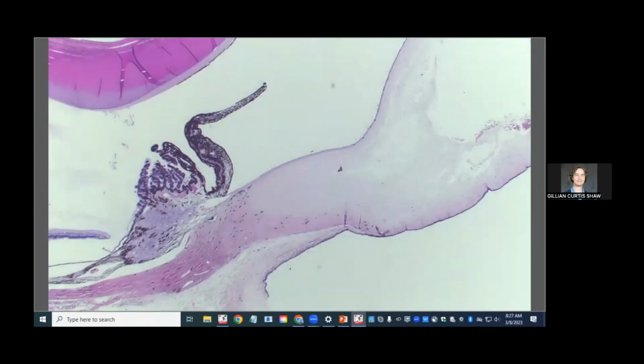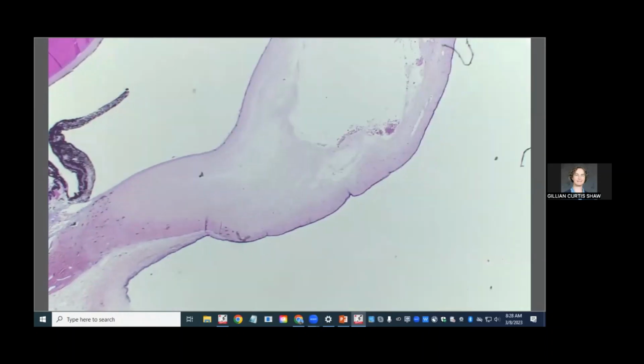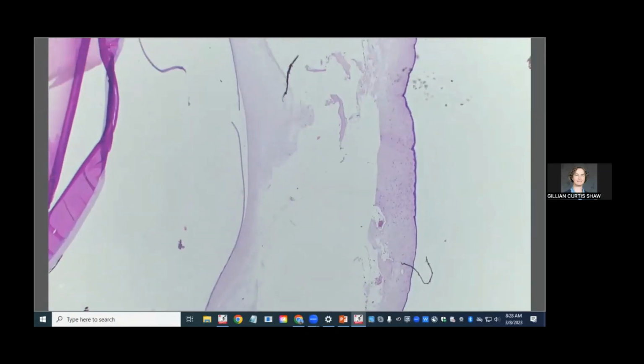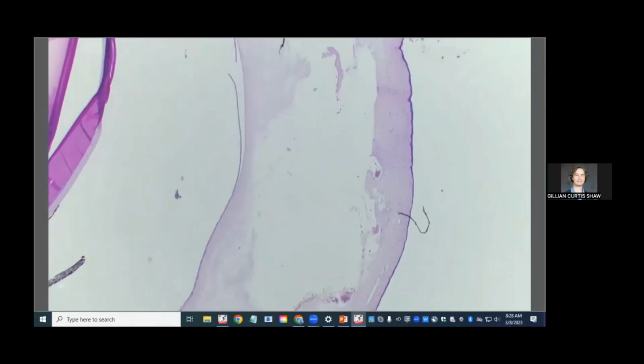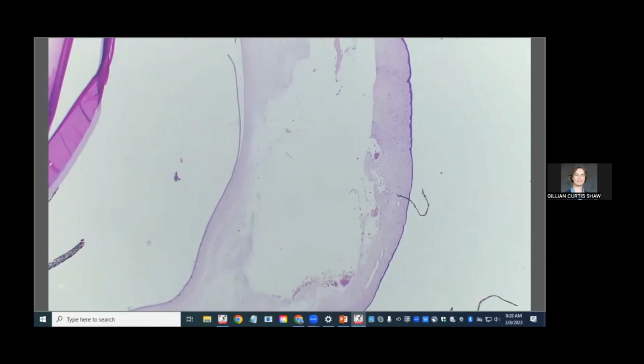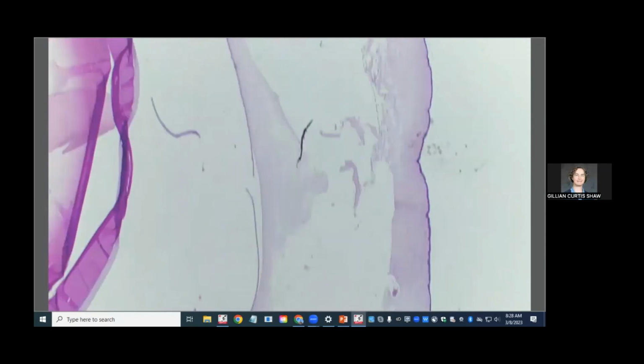So at the periphery of the cornea, we have a much more normal looking stroma. We still have the maintenance of those lovely parallel oriented stromal fibers as it should be. That's how you get your optical clarity in the cornea, or part of it. But as we go towards the axial cornea, the cornea is severely expanded by clear space. There are basically just these enormous lacunae. Sometimes they have a little bit of hemorrhage in them even, but otherwise just sort of empty space.